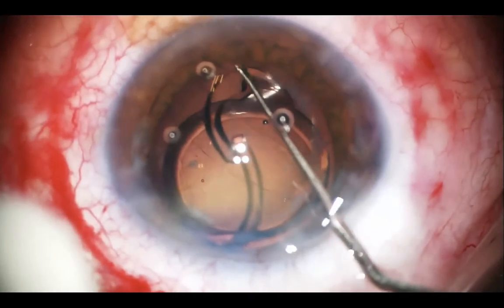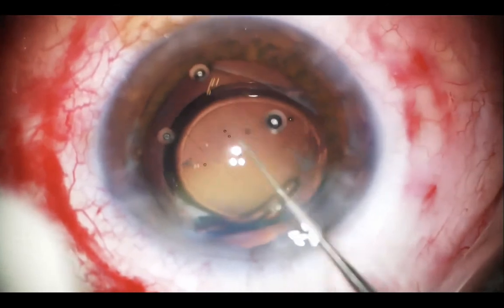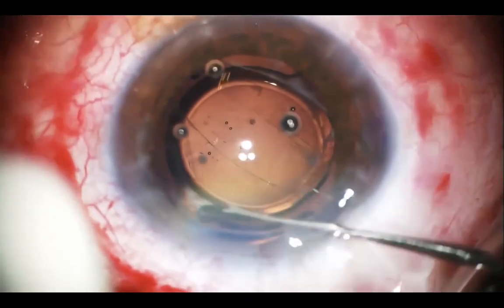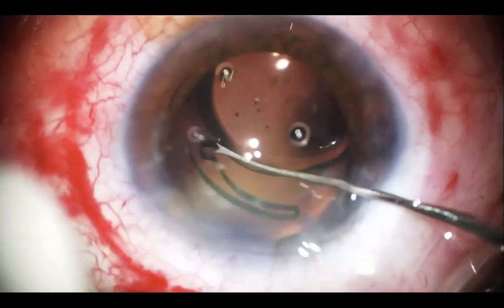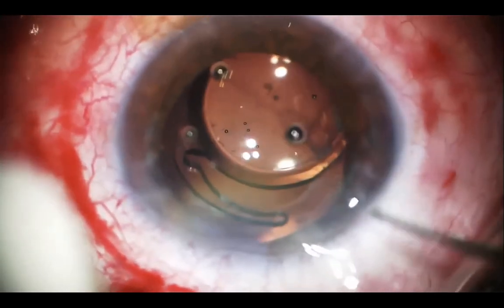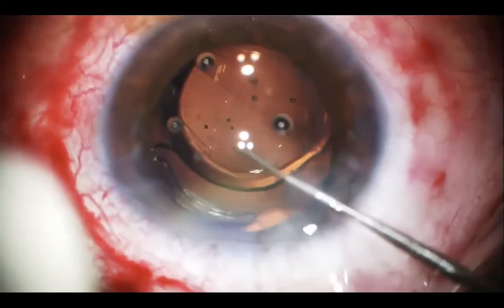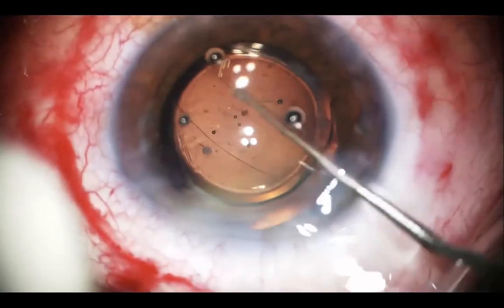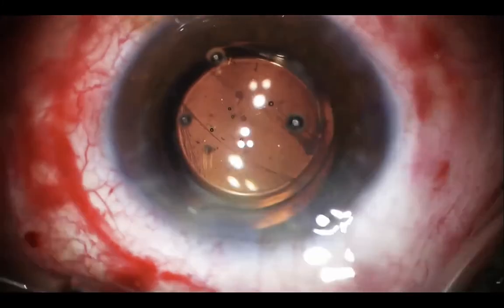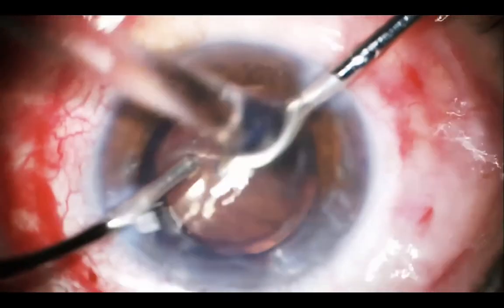And this is a hydrophobic lens, and sometimes this lens may have the kissing haptic phenomenon. We can take advantage of this kissing haptic phenomenon. We have some time to manipulate the lens inside the capsular fornices to bring both haptics into the capsular pockets on either side before complete unfolding of the IOL. So you can see here now the lens has been implanted inside the capsular bag.